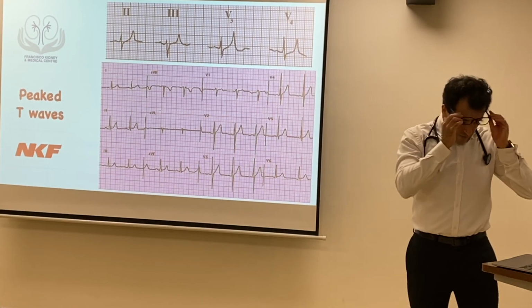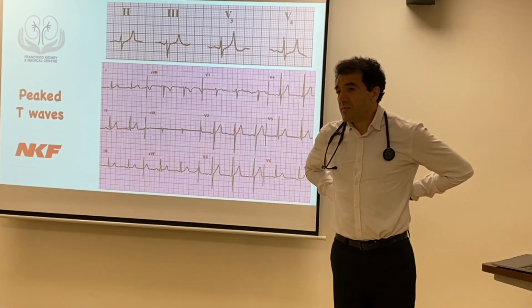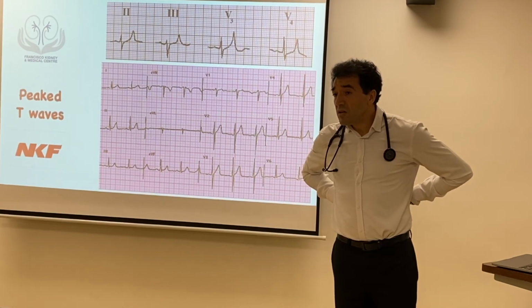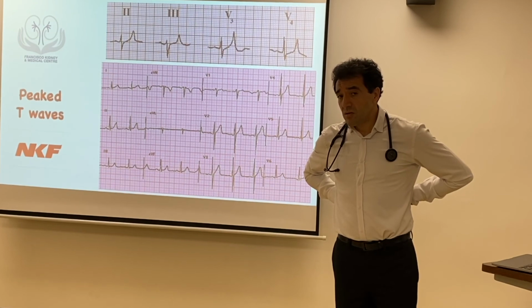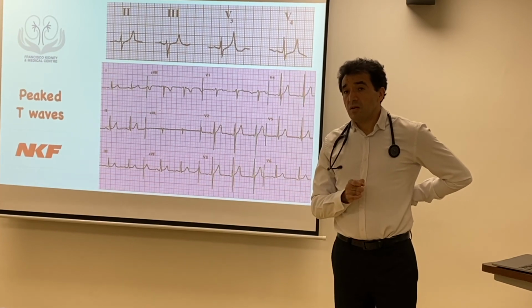Oh yeah. Previously we had one patient. The ECG shows PVC, premature ventricular contraction. But when we use the machine to check the pulse, it's 30-40. When we do the ECG, it's 80-60. Then the doctor said okay, can continue dialysis. So what's the reason the pulse cannot be picked up by the machine?